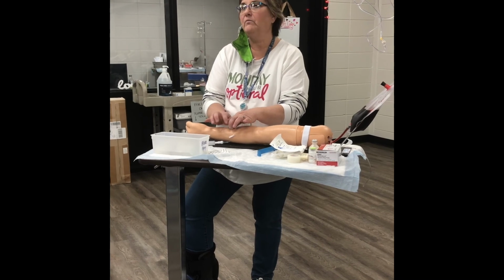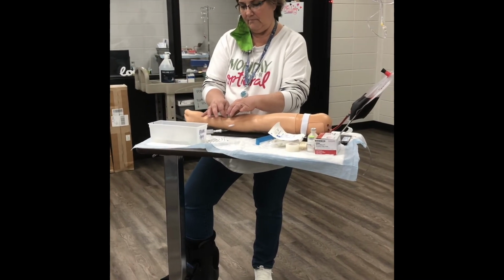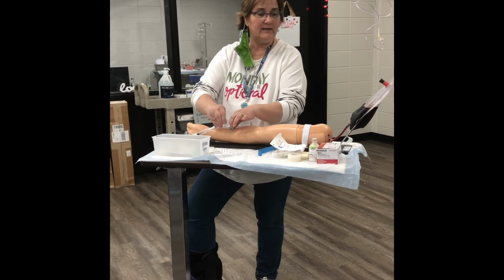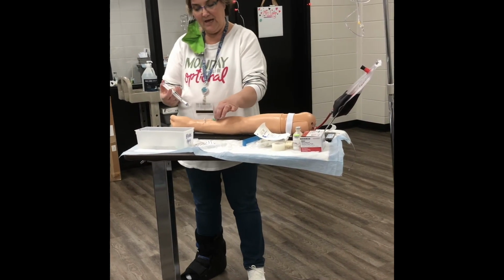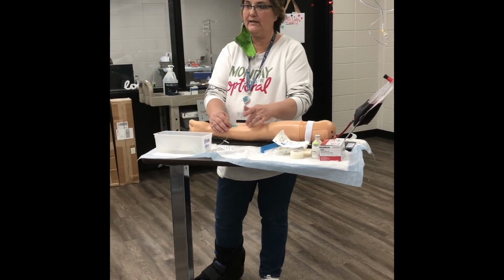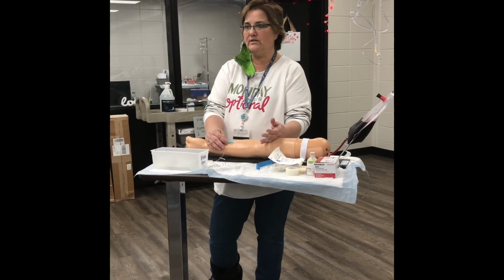Now, you want that on there as tight as you can get it. Now, at this point, I'm going to unclamp my syringe, and I'm going to flush this with 1 to 2, or about 1 really. And I am looking for swelling at the end of my site. If they say, oh, that hurts, it shouldn't hurt.